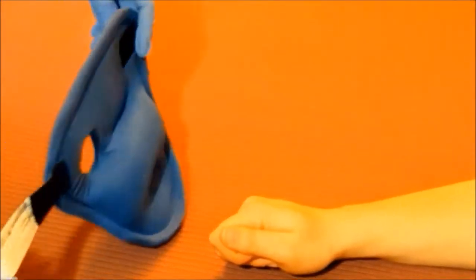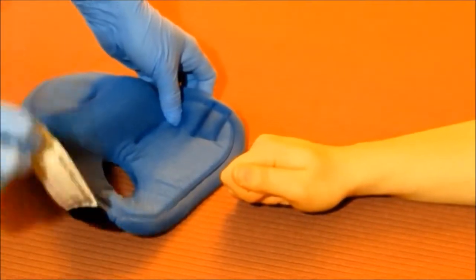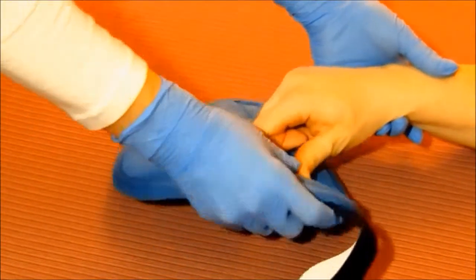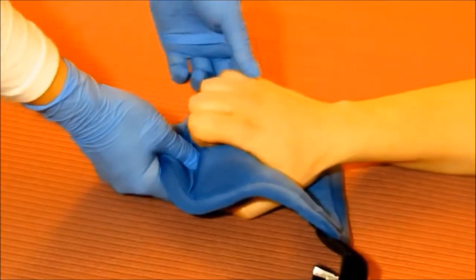Position the Premium Palm Protector under the patient's palm, both the strap and the Velcro facing downward. Gently guide the patient's thumb into the thumb hole and ease the fingers over the cylinder roll.